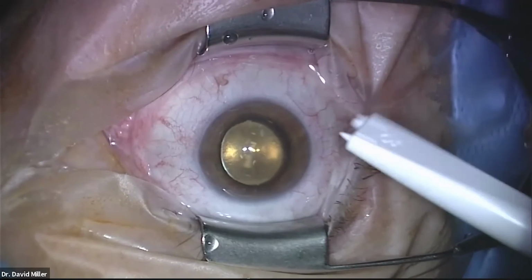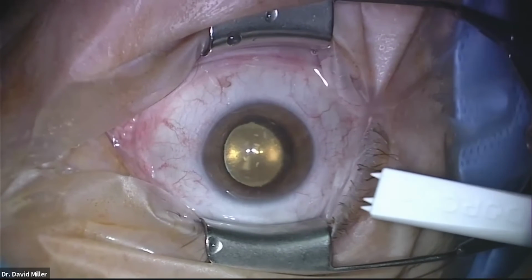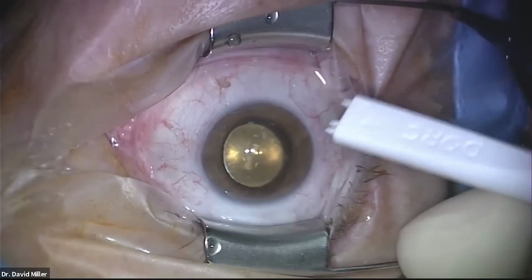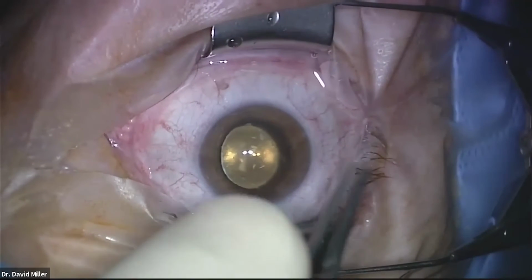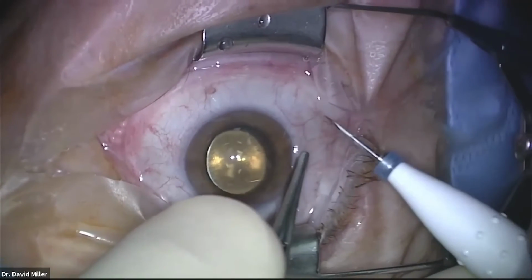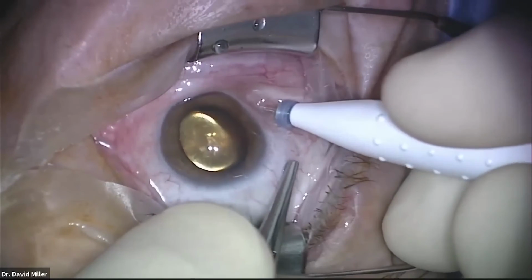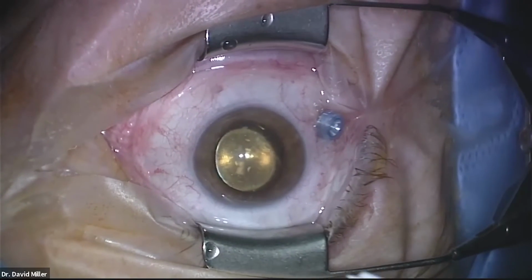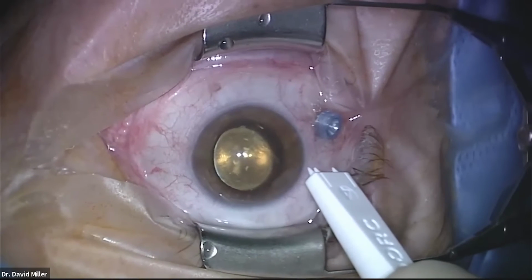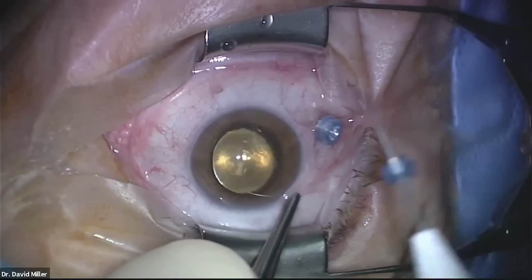I'm hesitating. I always pause here when I do this part, you guys, because I don't usually measure much anymore. We kind of just go. But again, anyone starting out, I think measuring is always safe. I prefer not to hit the old wounds, by the way, if I can avoid it. So fortunately, not many people operate on the horizontals, and I'm usually pretty safe down there.